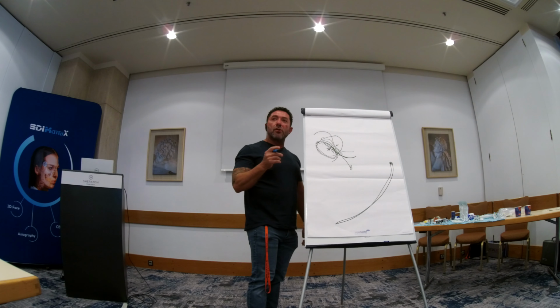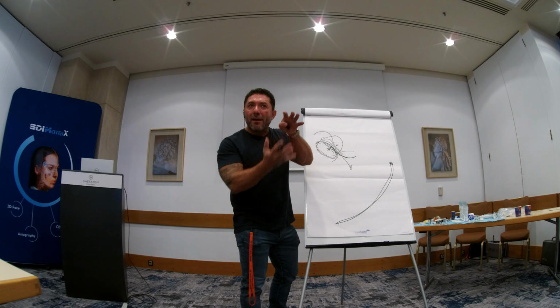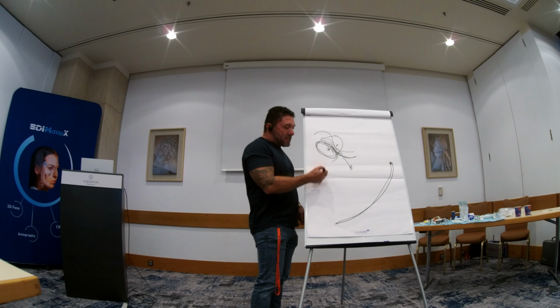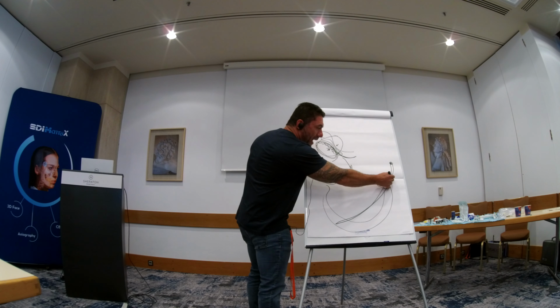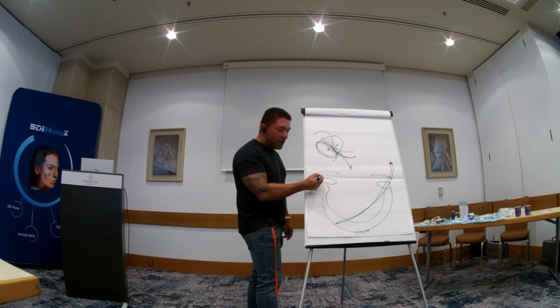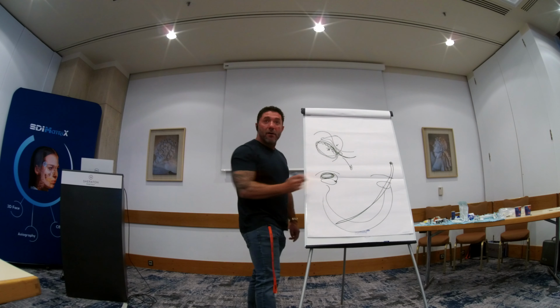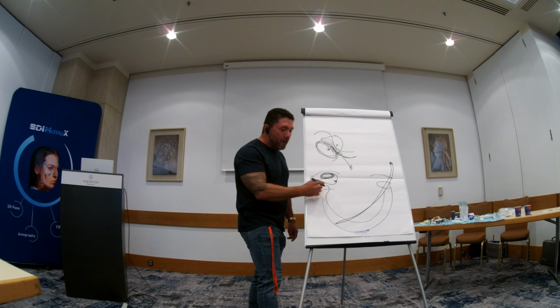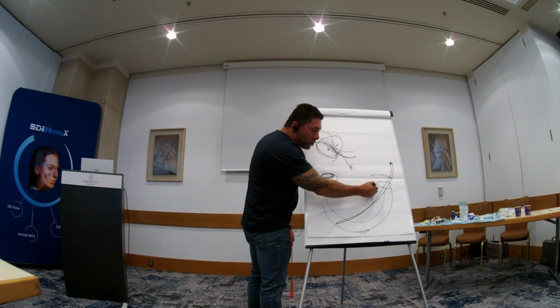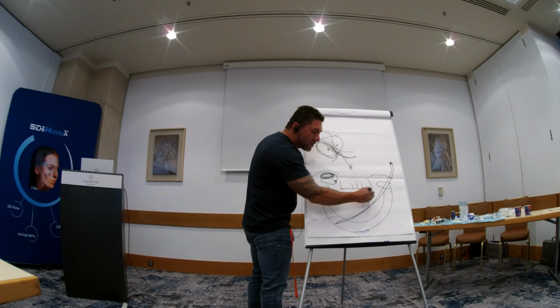So what Eugene is showing when he's talking about the way that we can digitally unpack the joints is that we can see the two temporomandibular joints connected, and then we can see the behavior, that one can be more closed than the other one because the disc is out. We can have the alternative to open that space on that side only, if it's on one side, to force the jaw to change, which is going to change the relation between the upper teeth versus the lower teeth.